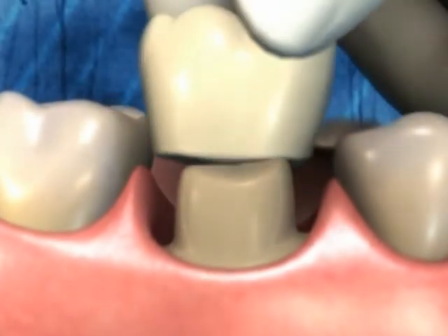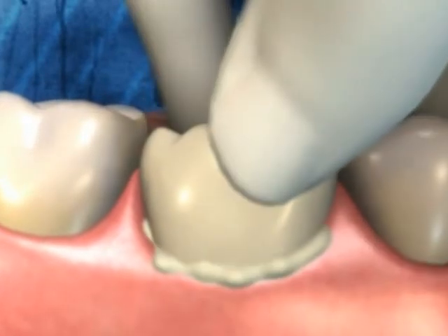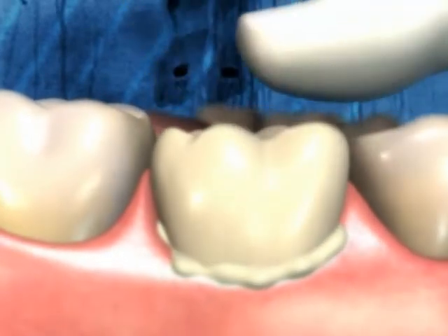The result is a coping or full contour restoration that fits properly with minimal adjustments.